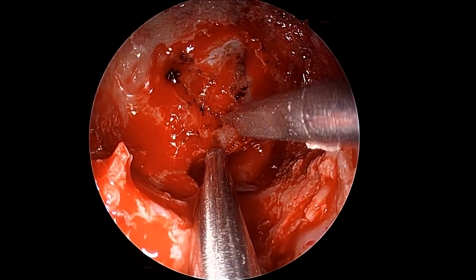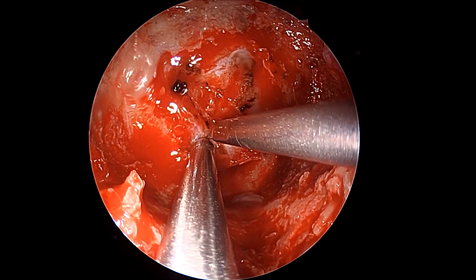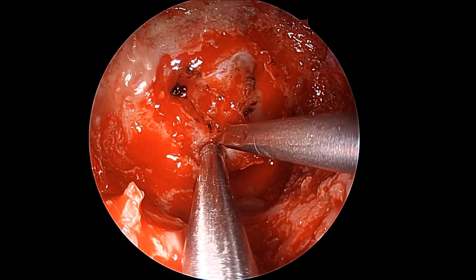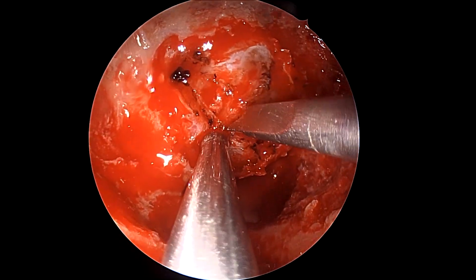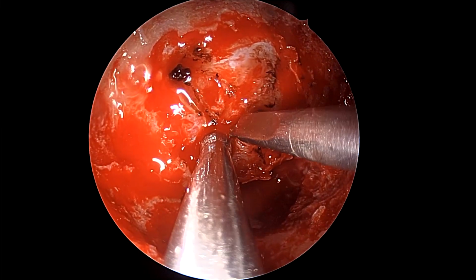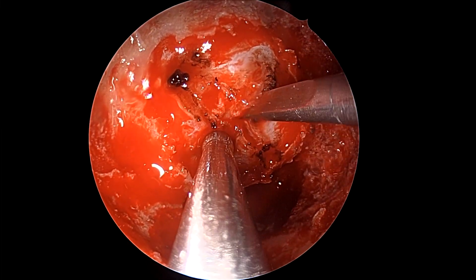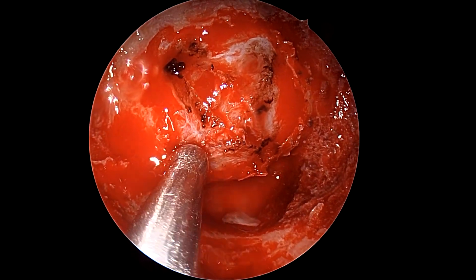And you can see now how we are going on to the horizontal side as well, making a complete cruciate incision. Once you make the initial limbs, we can always use our standard microsurgical scissors, endoscopic scissors, to widen the incision, followed by actual addressal of the tumor.